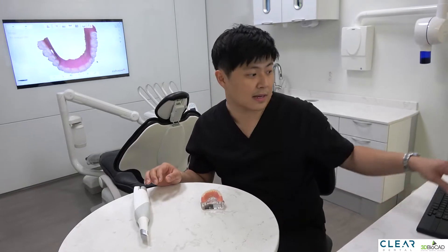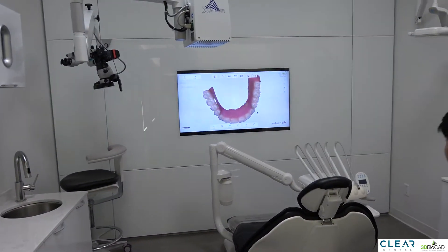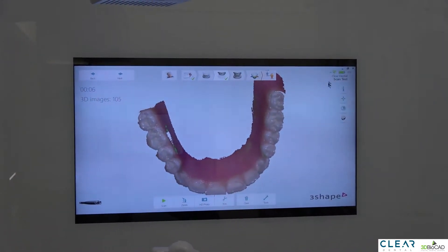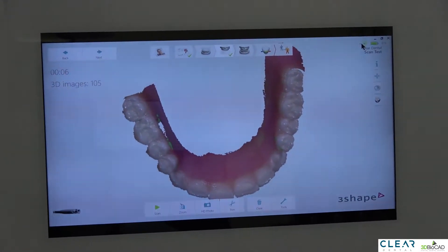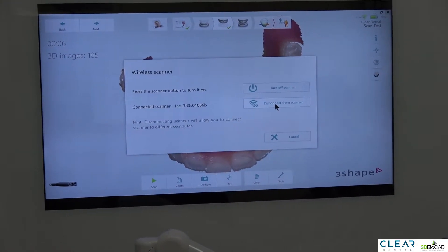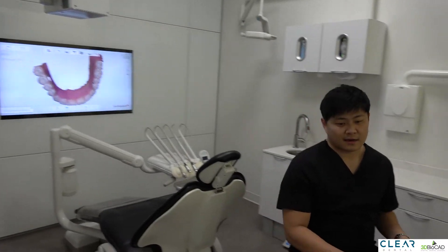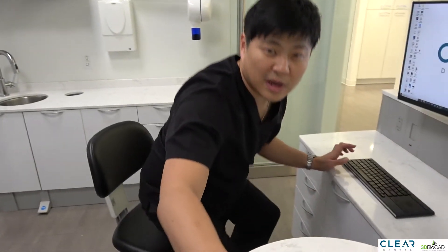Let me show you how we do that. If you look at the TV screen and click on the TRIOS icon, there's an option for disconnecting the scanner from the computer. You just press that and then the scanner is disconnected.